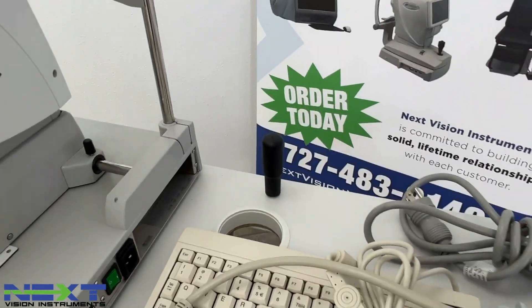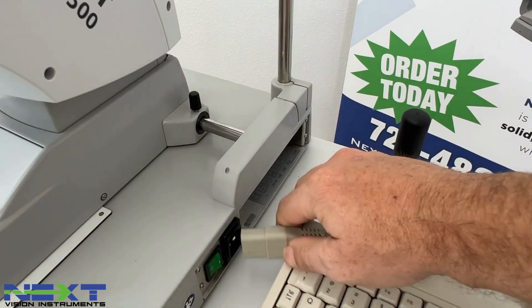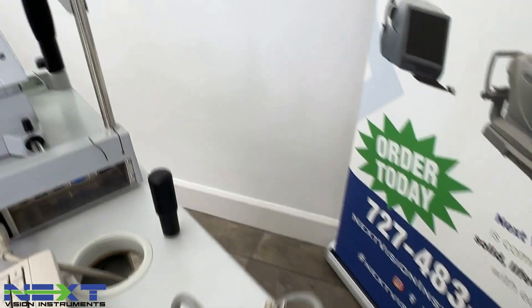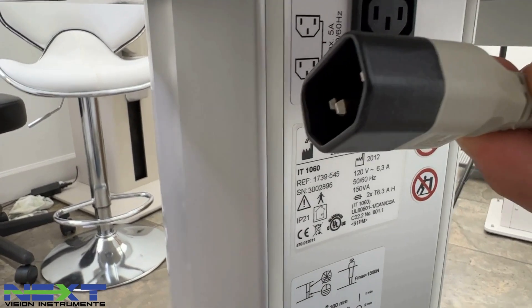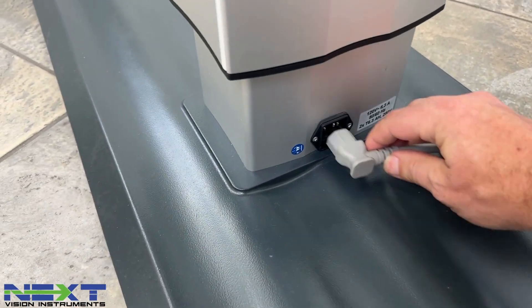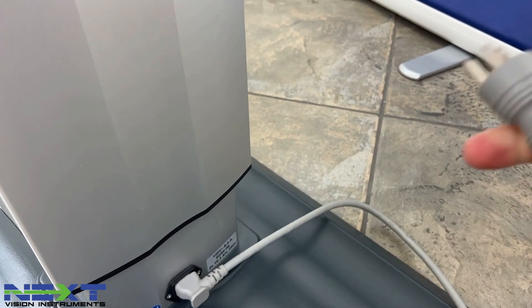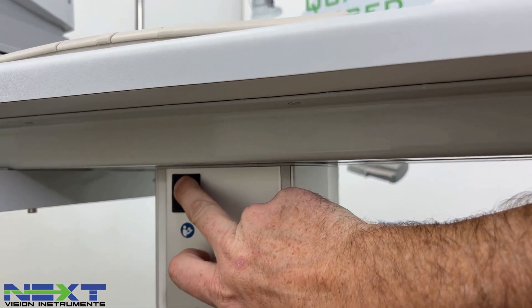This short cord goes through the table so the unit gets power — plugged in here and plugged in here. On the back side, the other end gets plugged into the table. We'll take our power cord, go to the base of the column, plug this in, and plug this into the wall. At this point your table should have power.